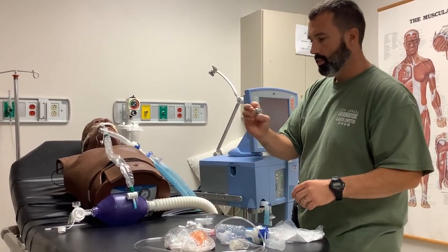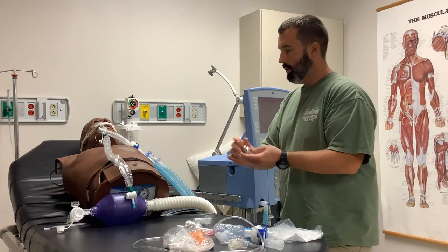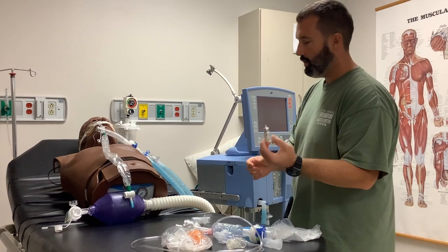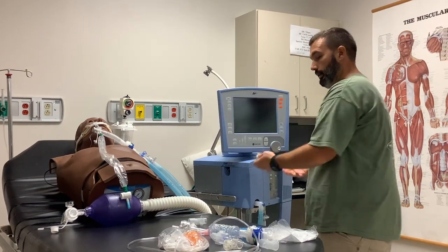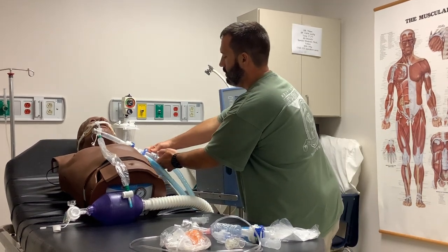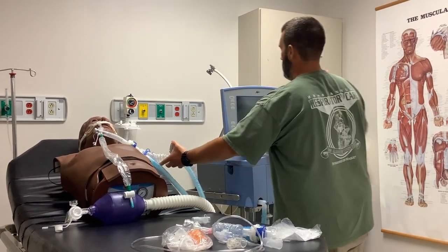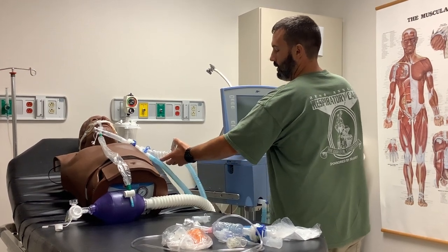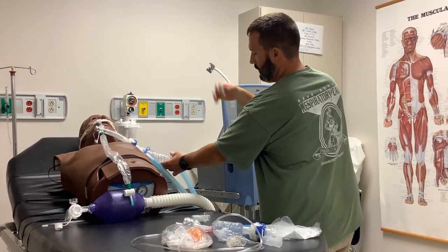For your MDI canister - this happens to be an old Proventil canister. You should clean the tip off with an alcohol prep, shake it up and down to mix the propellant. You don't necessarily have to warm these as this is an HFA inhaler. You want to break this loose, coordinate with the ventilator, and allow it to give a breath. After it fires a breath, you hit the inspiratory hold button, depress the canister, and then with a gloved hand you can cover back up. You should shake in between each actuation to mix the propellant.